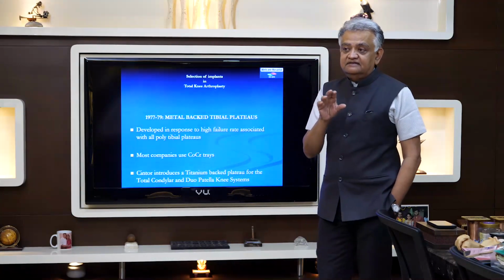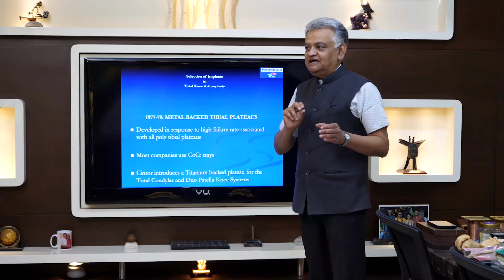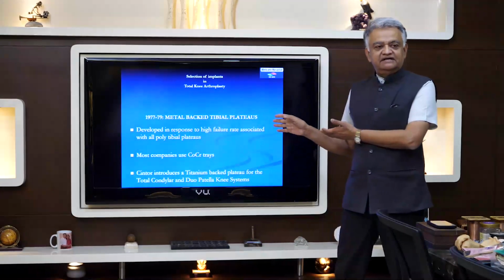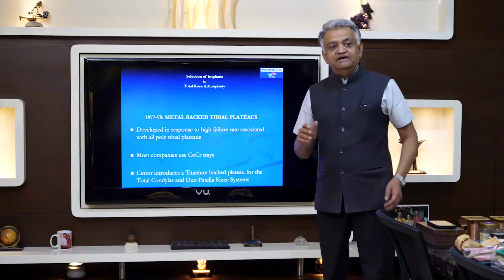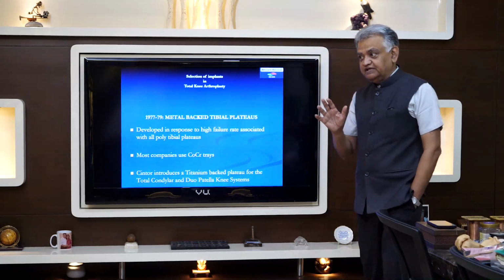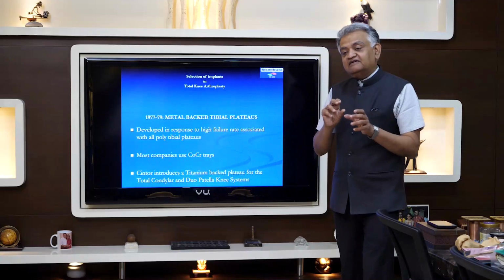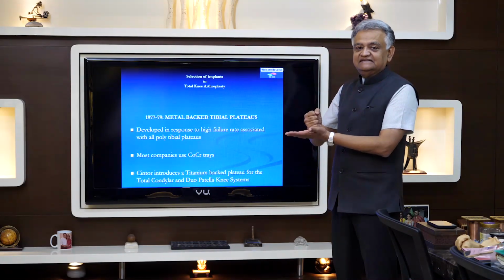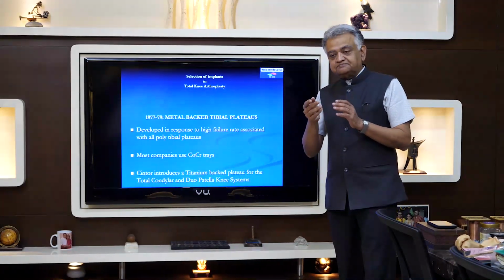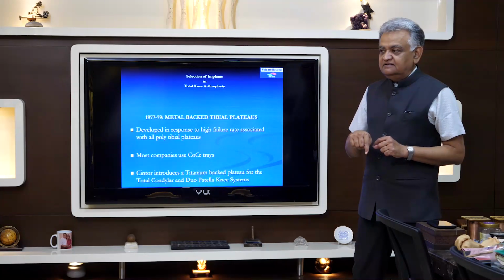But the most likable feature that a young surgeon has, which means the ability to change that insert right up till the last moment so that you can balance the knee to your satisfaction, was not brought by the big names like Michael Freeman, John Insall or Chitranjan Ranawat. It was brought in by equally intellectual giants, but their names were Dr. Iftekhar and Dr. David Murray, both of them working in the US. Iftekhar brought a system of modularity, but in his case, after trial, before inserting the final implant, you had to fix the plastic insert solidly with the metal tray and then use it like a monoblock. Whereas David Murray changed it to the point where he actually allowed the implantation of the metal tray with cement, and then you could put in the final plastic insert the way in which you do it these days.